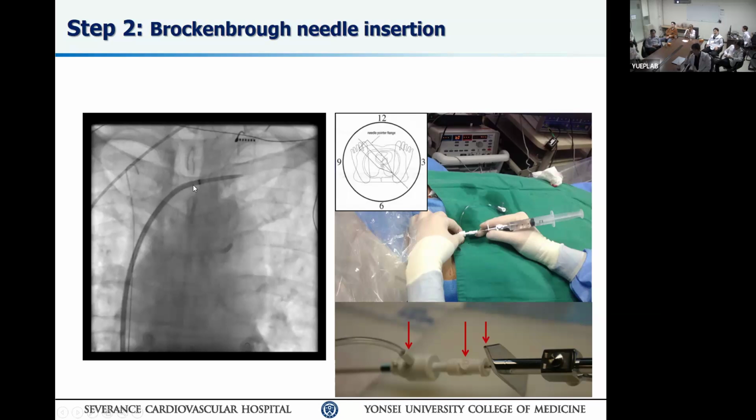And usually the radiopaque line here is not deviated. If you see it is deviated, then the pointing of the apparatus might not be at an appropriate angle. With the pointing of the apparatus at 5 to 6 o'clock, you will descend the apparatus through the SVC into the RA.